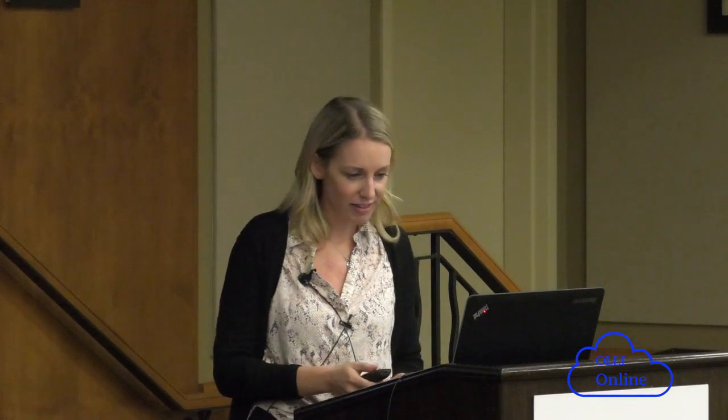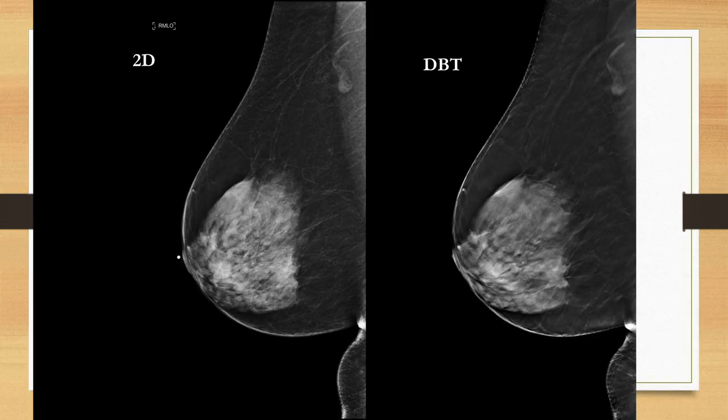Just to show a couple cases of 3D. I can't do the movie in here great. The PowerPoint wasn't working well. But this is a 2D mammogram. So this patient has really dense tissue, right? So you see, like, what is this? What is this? It's all white. Who knows? We probably would call this normal on most days.